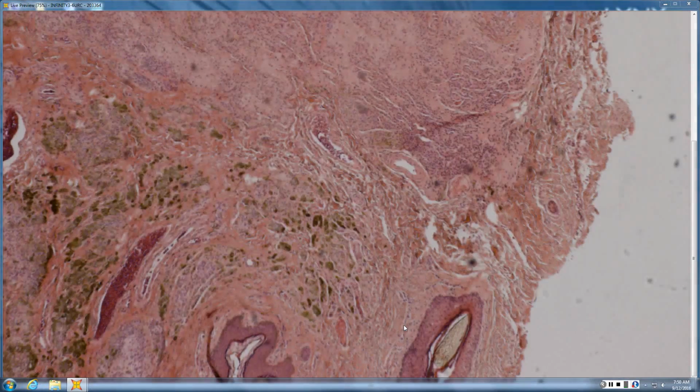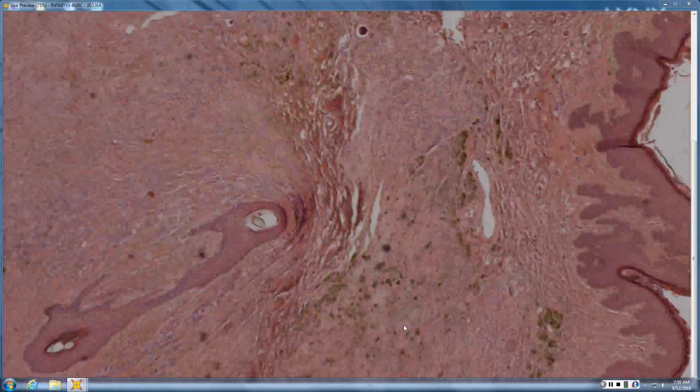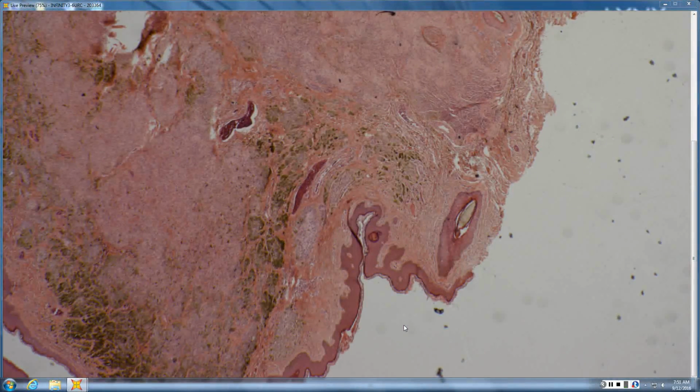Very good. So a pretty massive proliferation of pigmented cells, likely melanocytes. Yep. At the top, there are certainly very well-defined nests, and as it gets deeper, it becomes a diffuse population of cells, and they don't really seem to mature per se. Yeah. And they don't really singly disperse.